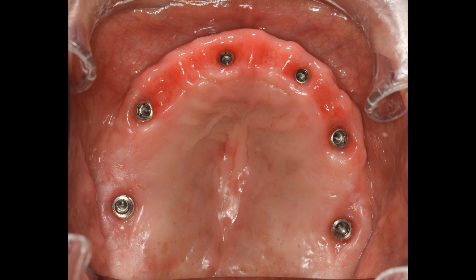The redness that you see here, that's simply because the plastic temporaries, the acrylic temporaries, sometimes cause people to have a slight allergic response. One week after getting the zirconium and this will all be pink like the rest of the picture.